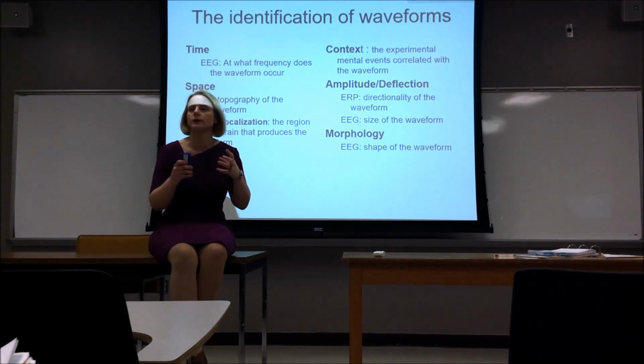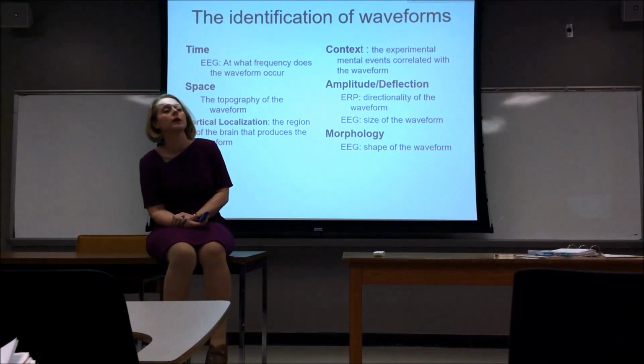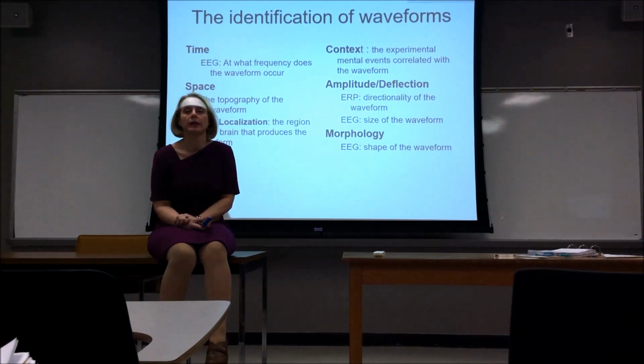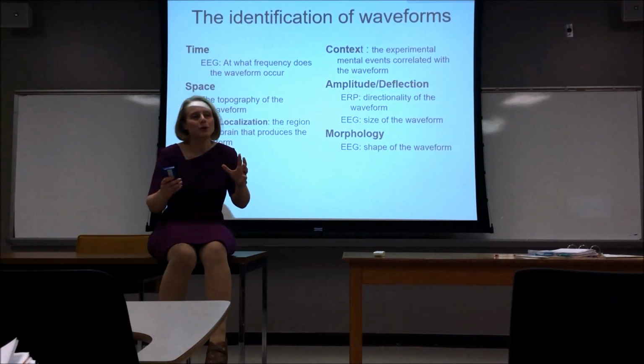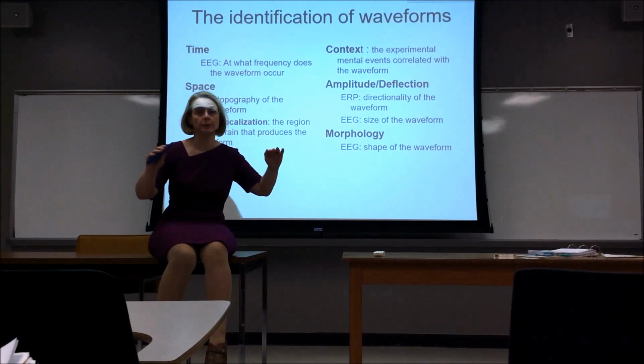And so the context of what's going on matters. If you see delta in somebody in a normal circumstance and they're alert and they're awake and they're focused, there's something damaged in their cortex. However, if you pushed yourself beyond the state of exhaustion, your brain will try to go to sleep. Your brain will go, you need some sleep now.